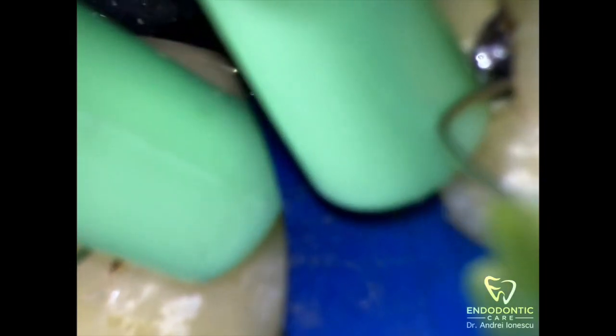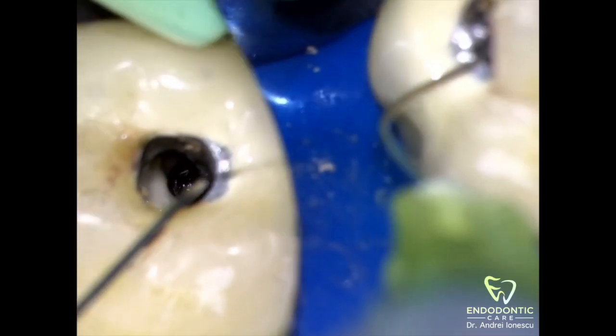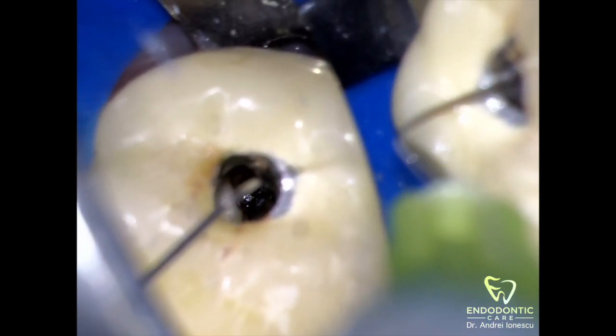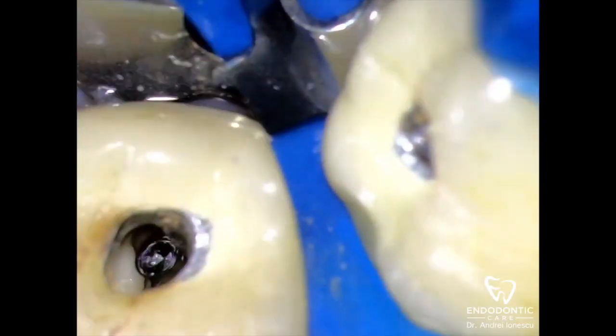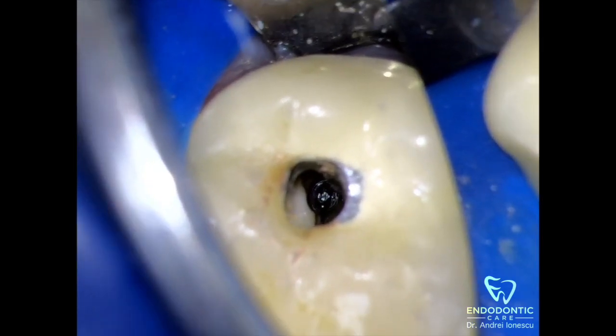So always try to bypass it first — it adds a lot of benefit, but don't spend too much time on it. I was able to get a file on both sides of the separated instrument, and once that was done you can move on to the trefline burr and create a little trough around this file.